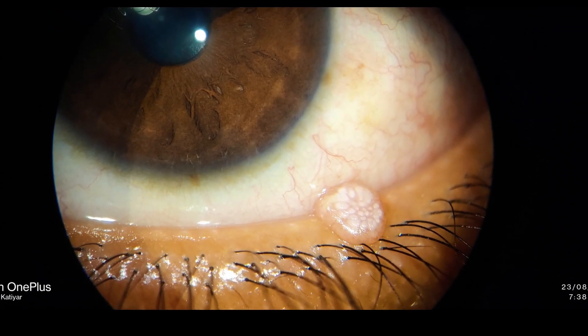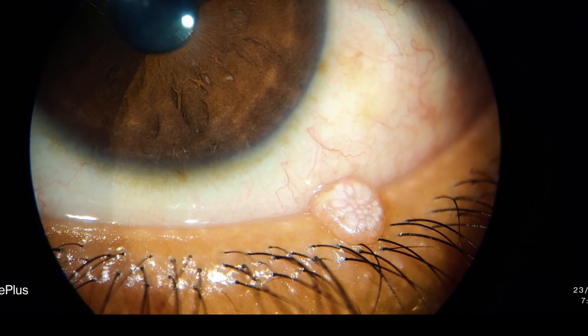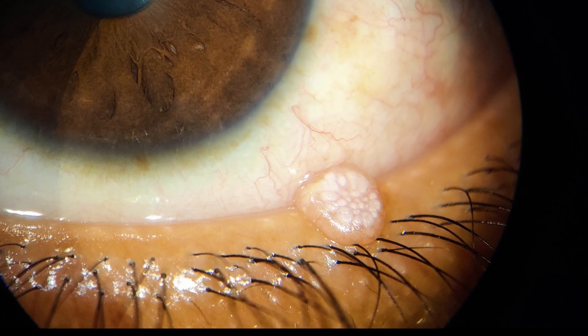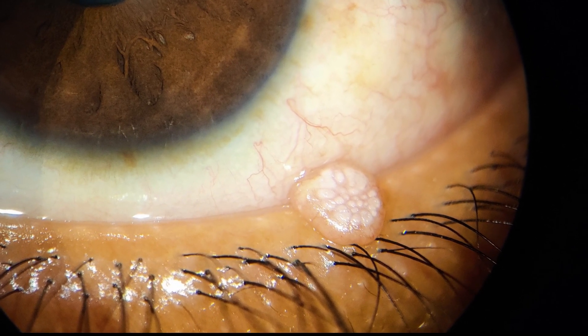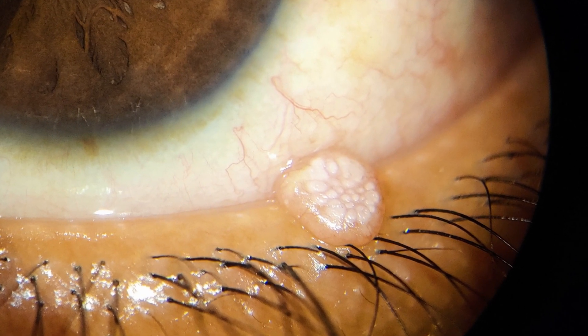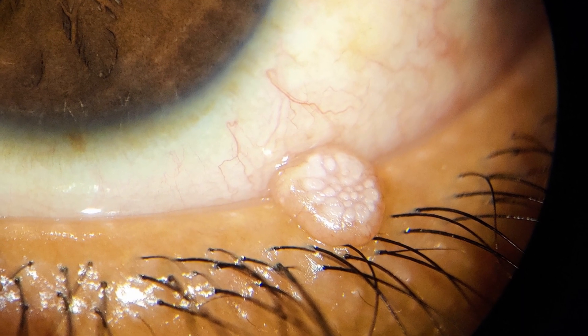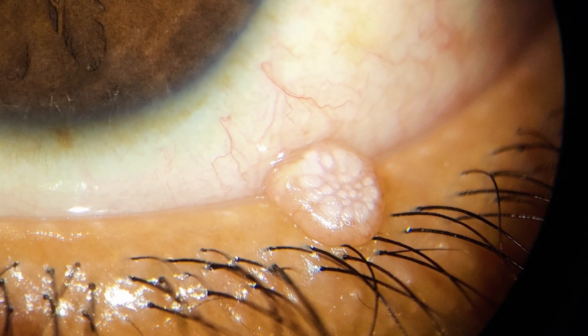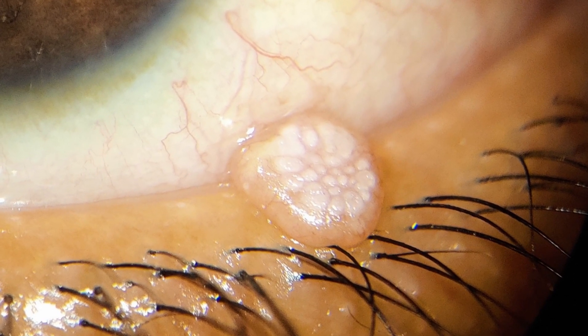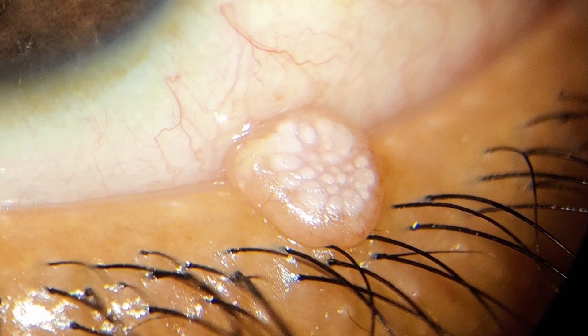This patient has a lesion at the lid margin, and as we can see it is a typical molluscum contagiosum lesion, which is commonly seen in children and adults. This is caused by the molluscum contagiosum virus.